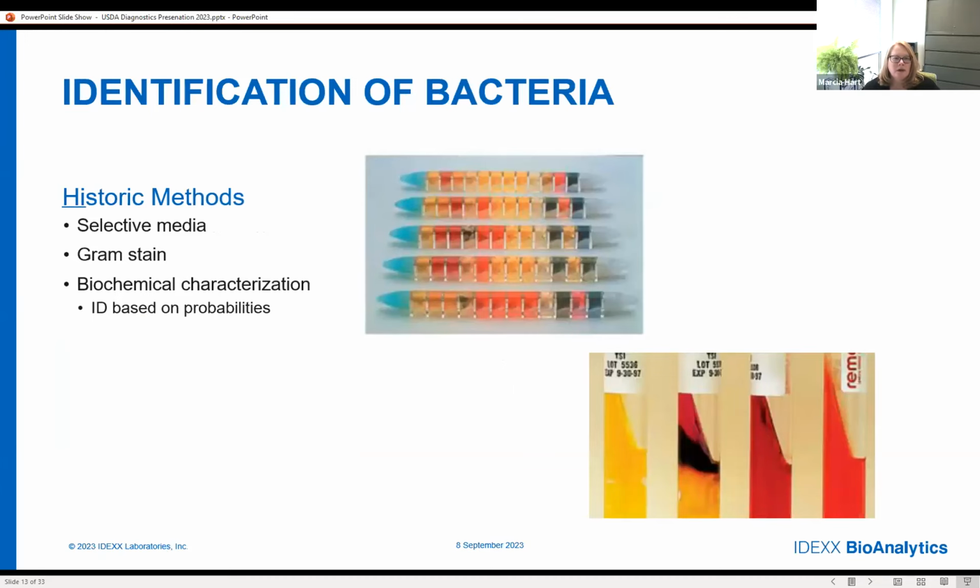When I talk about identifying the bacteria, how do we do that? If you think back to maybe a microbiology class that you had in college, you think about those unknowns where you just got an aliquot of some kind of bacteria or a mixed population of bacteria, and you had a battery of media that you had to try to grow those organisms on. And then you had to look at the media and figure out, okay, did it produce a gas? Was there a color change?